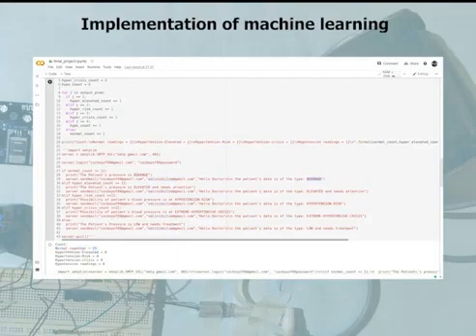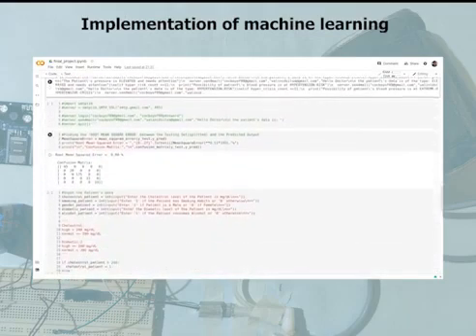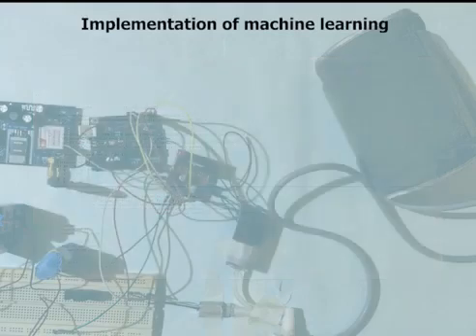Now in order to evaluate our model, we have used two measures. One is mean square error and other one is confusion matrix. If you look at the mean square error, it is 0.00%. That means our model performs well on both the training data and the testing data. Also, if you take a look at the confusion matrix, then the confusion matrix is ideal. That is, we get all diagonal elements. Here in this case, there are no misclassifications.